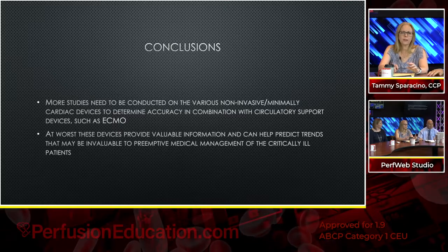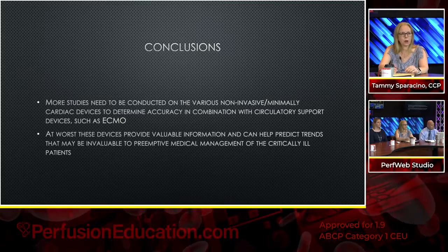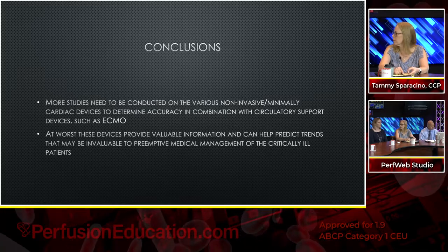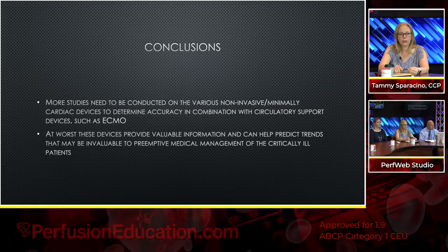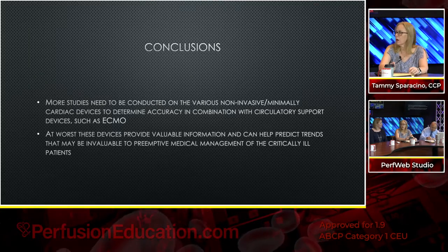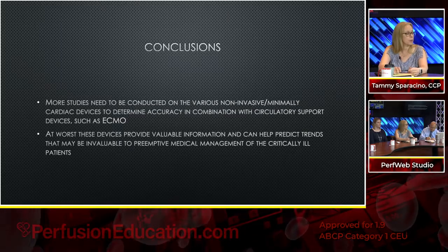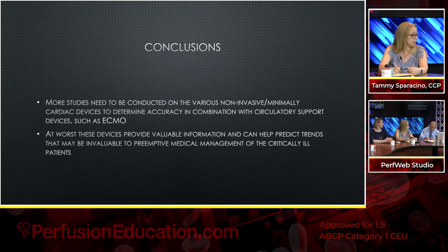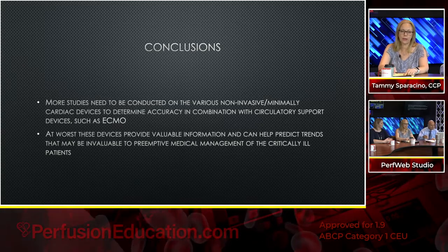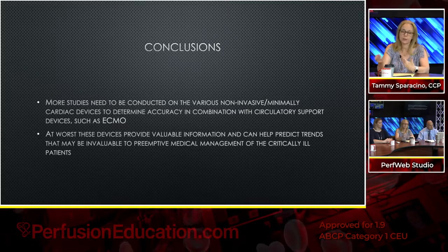So obviously more studies need to be conducted, and we need them to be specifically targeted at these devices, whether it be VADs, ECMO, or even the balloon pump, so that we can really look at these, especially because there are so many devices on the market, and although they all use the same basic idea, they all have different formulas. So I think we're going to find that some are definitely more effective than others, and it's going to depend on the particular situation. Maybe some are more effective in a hypovolemic type of situation, and maybe some are more effective when it's something else.